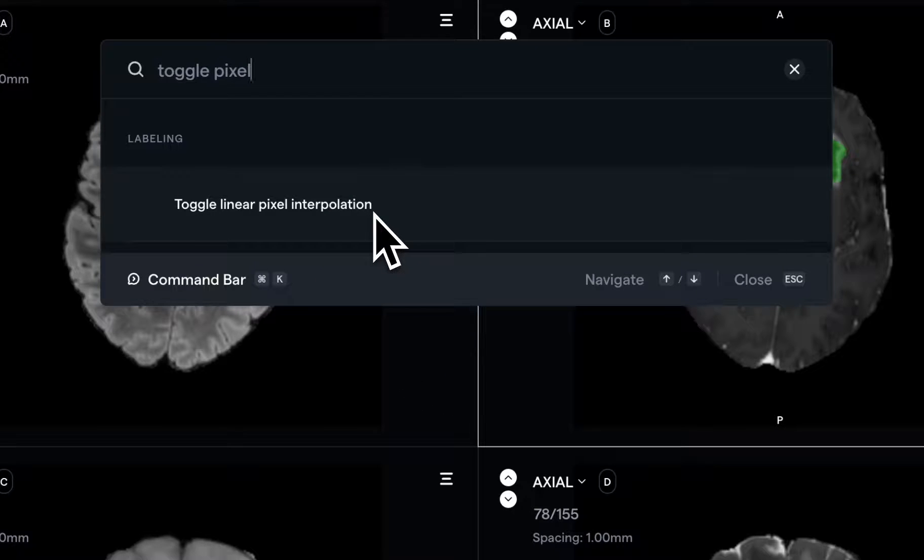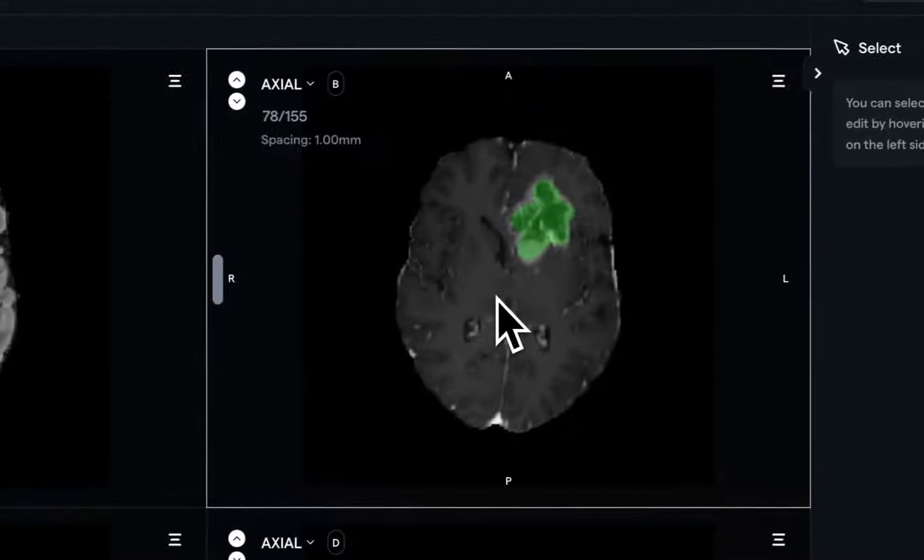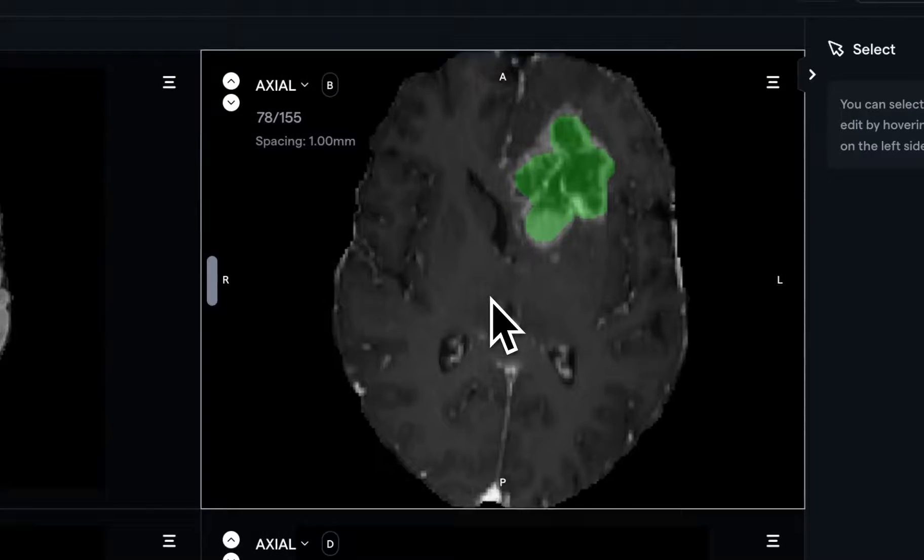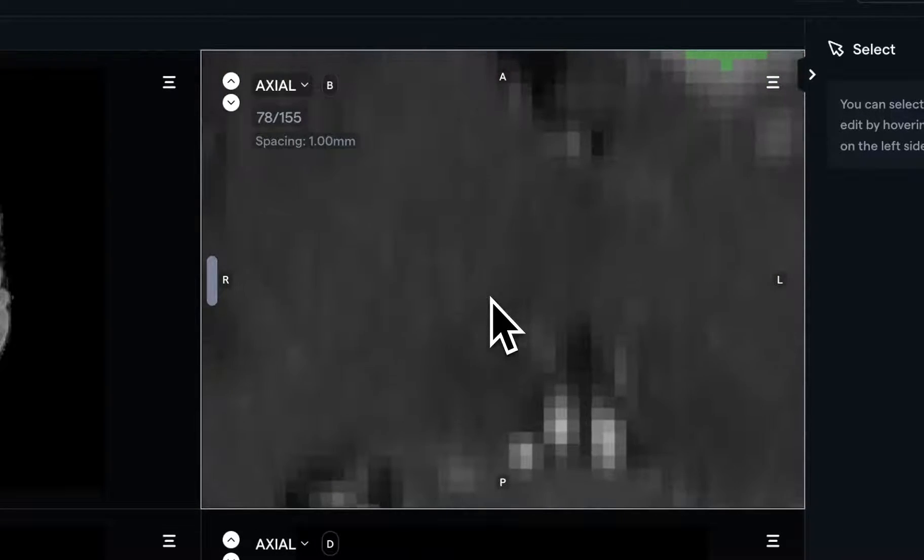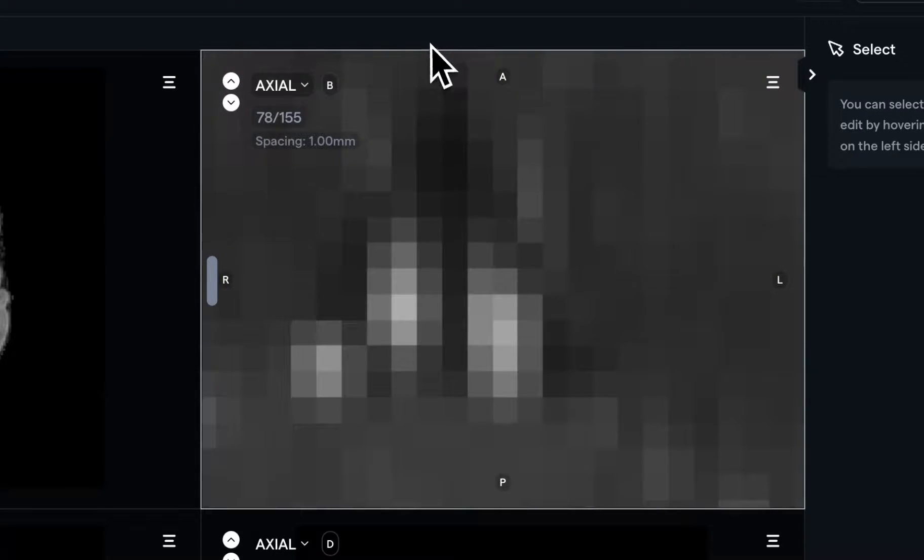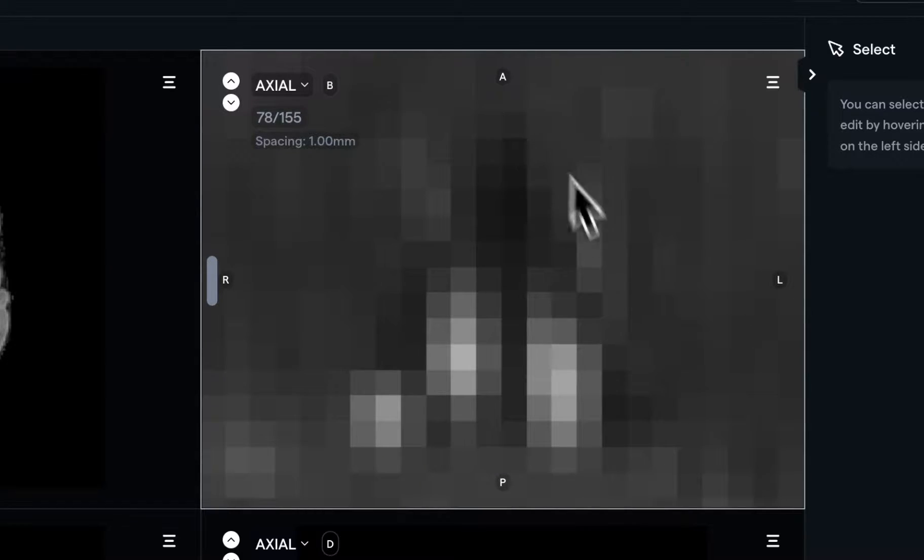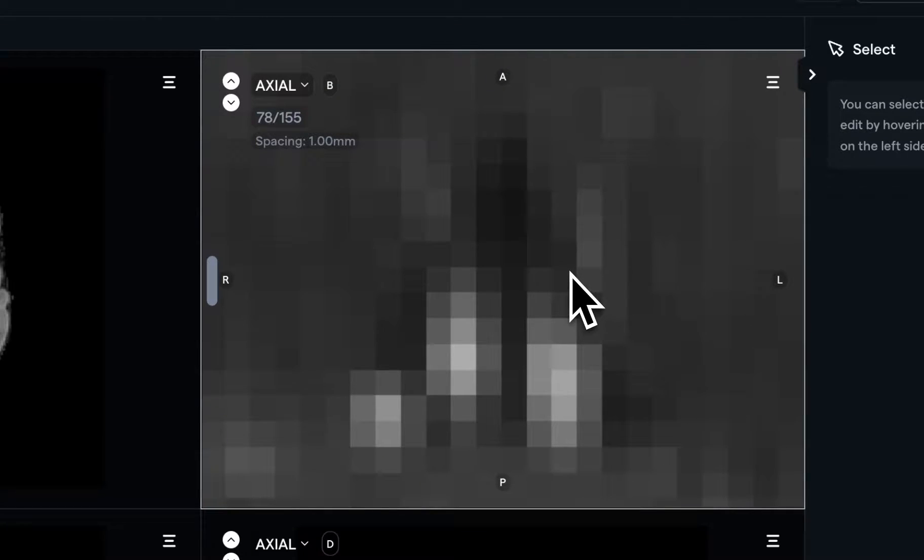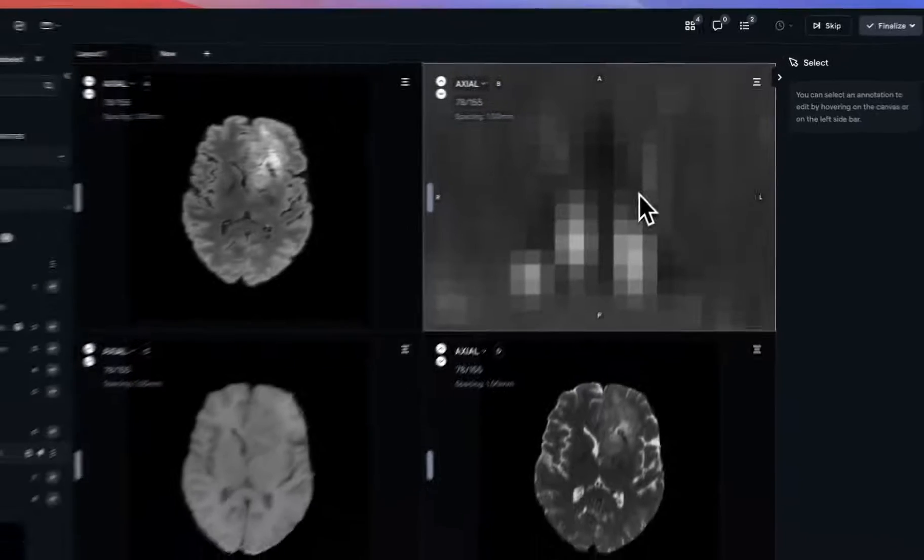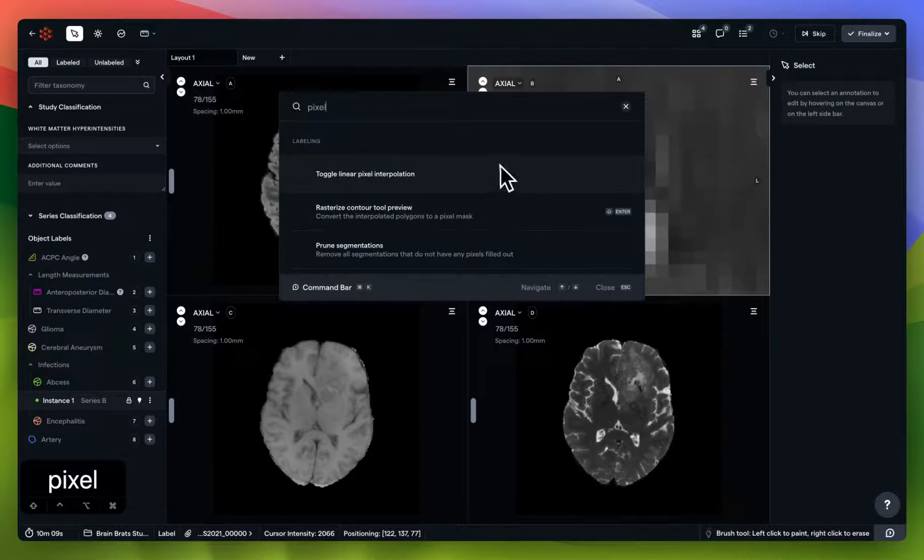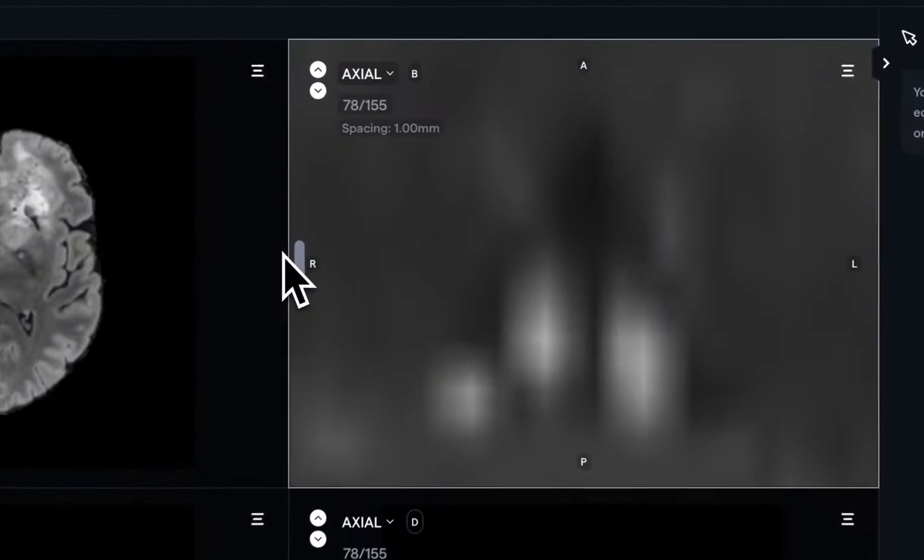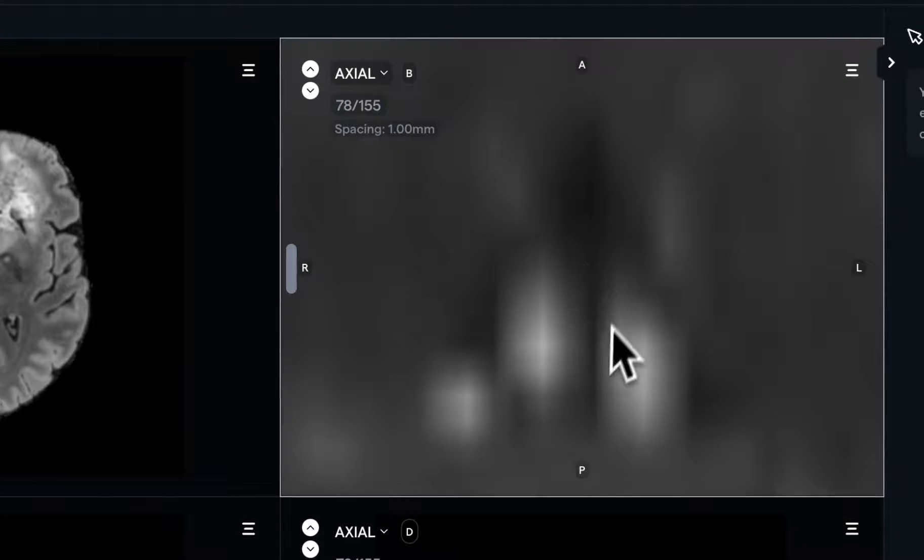And toggling pixel interpolation. So let's just do this quickly for series B. And I'll zoom in. And you can see how pixelated this specific display has become. I'll use Command K to open the command bar again, and toggle this off, so that we can quickly visualize the difference here. And there you go.